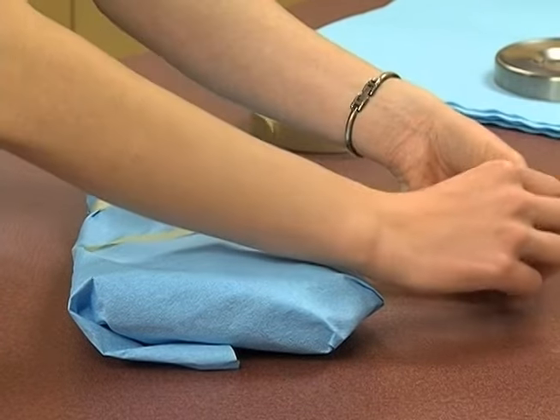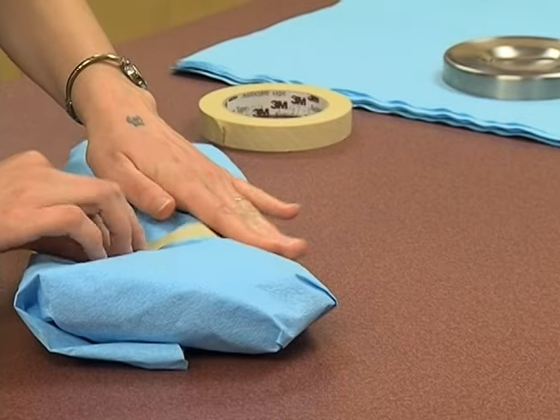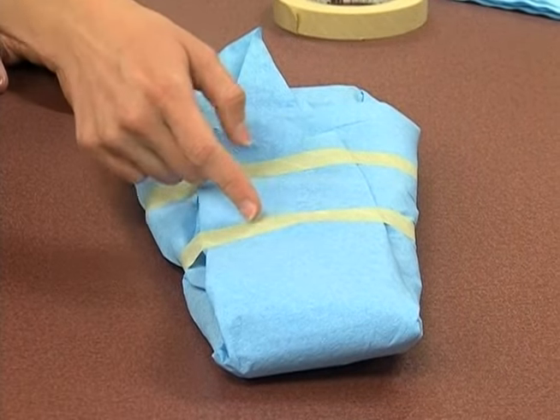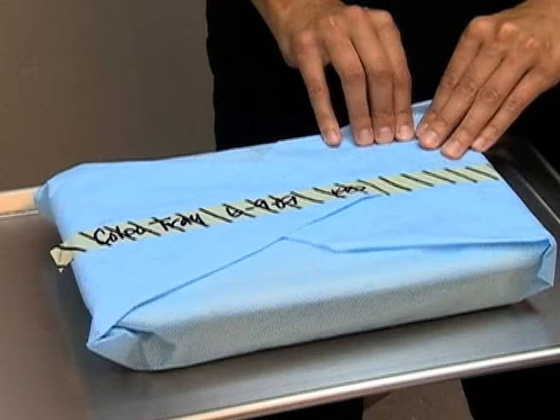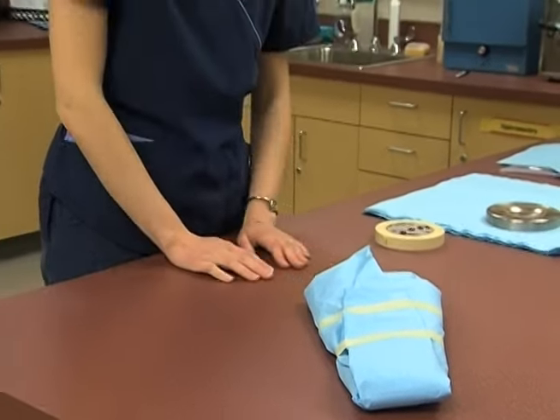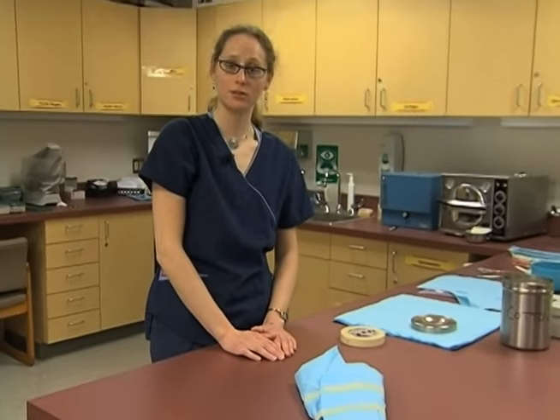I usually like to make a little fold at the end of the longer piece of tape so that it's easy to open. After this tape has gone through the autoclave, it will develop black stripes along the outside of it if the autoclave reached the proper temperature. This way we know that the outer part of this package reached the proper temperature, and our indicator strip on the inside tells us that it also got that hot on the inside as well.